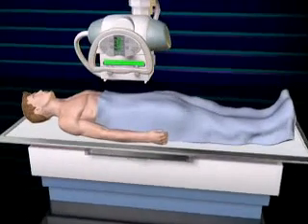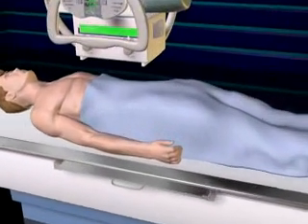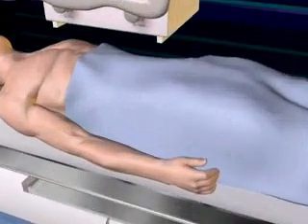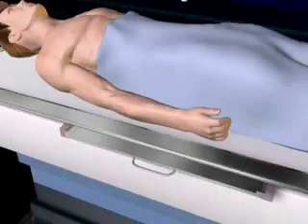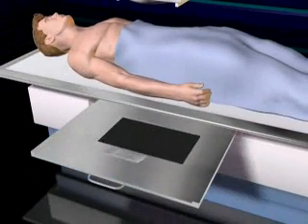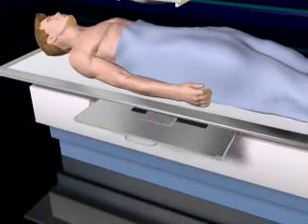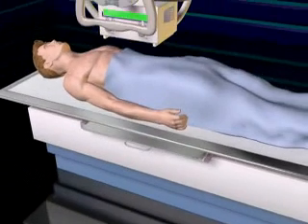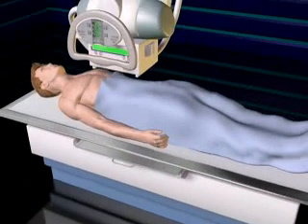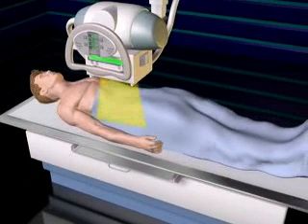X-rays are used to create images by shining a high-energy electromagnetic beam through the patient's body. This beam casts a shadow onto an x-ray film. A photograph of the internal structures is created through the shadows cast by the varying tissue densities.